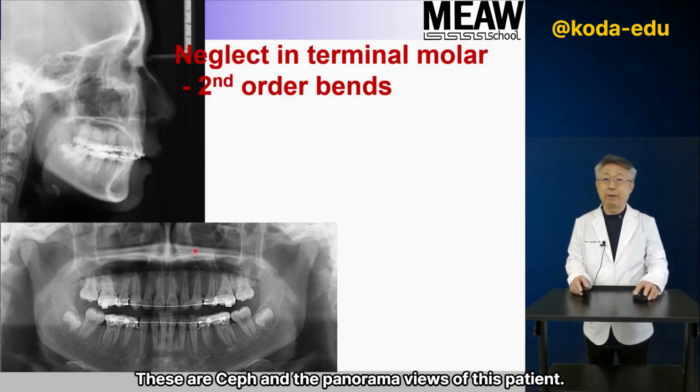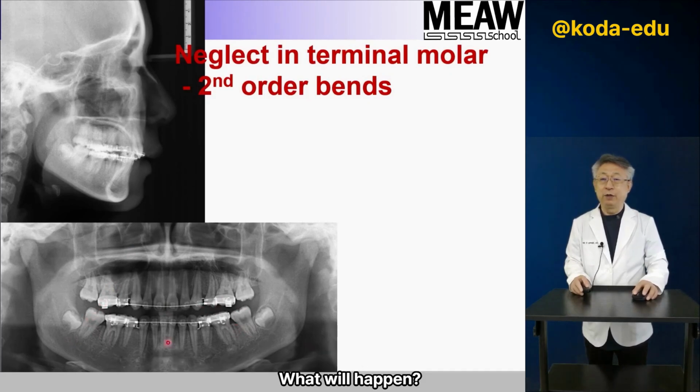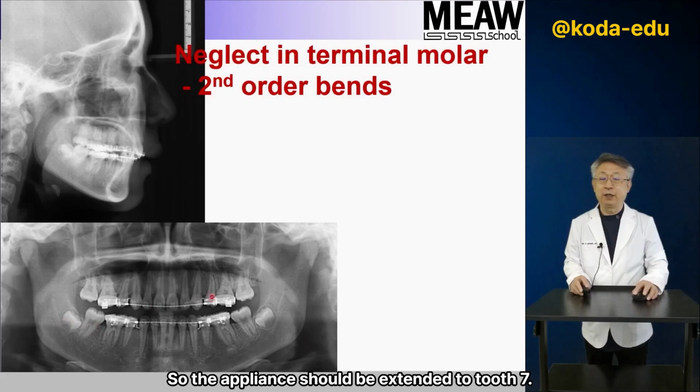These are Ceph and the panorama views of this patient. The mesially inclined mandibular second molar was not uprighted because the appliance was not attached to the tooth 7. What will happen? As wisdom teeth erupt, it is highly likely for the mandibular second molar to be inclined mesially, so the appliance should be extended to tooth 7.